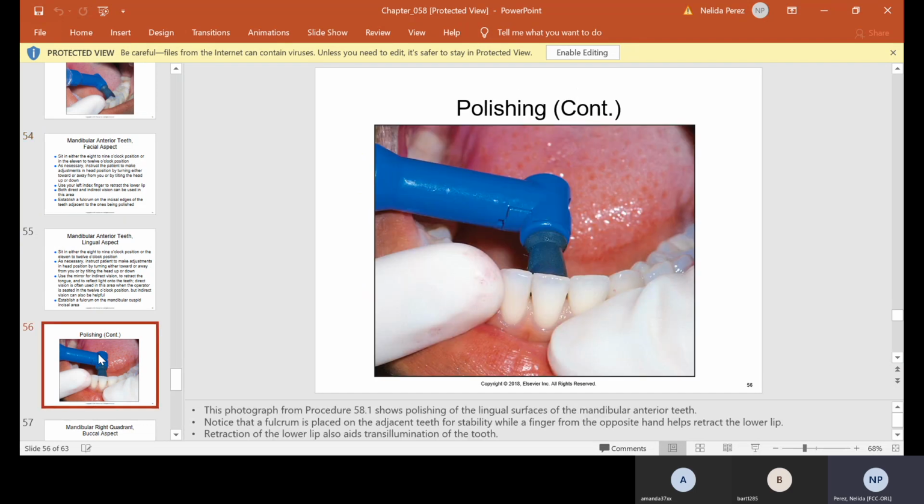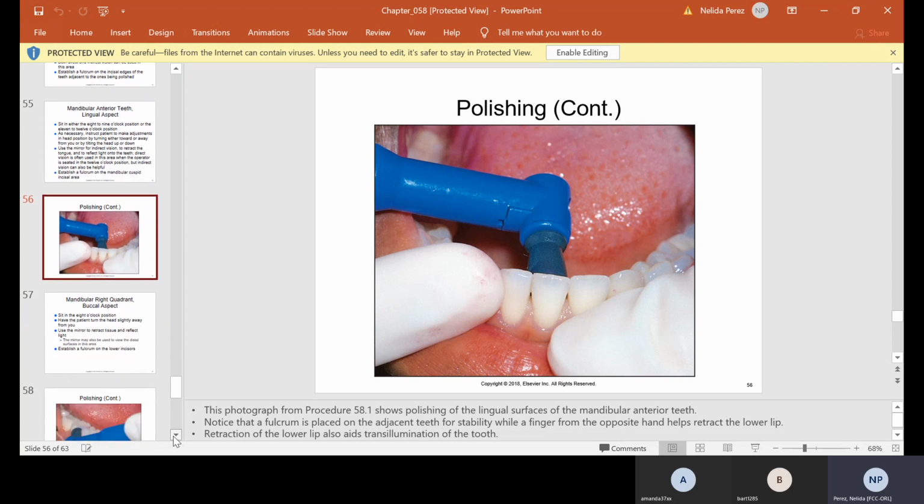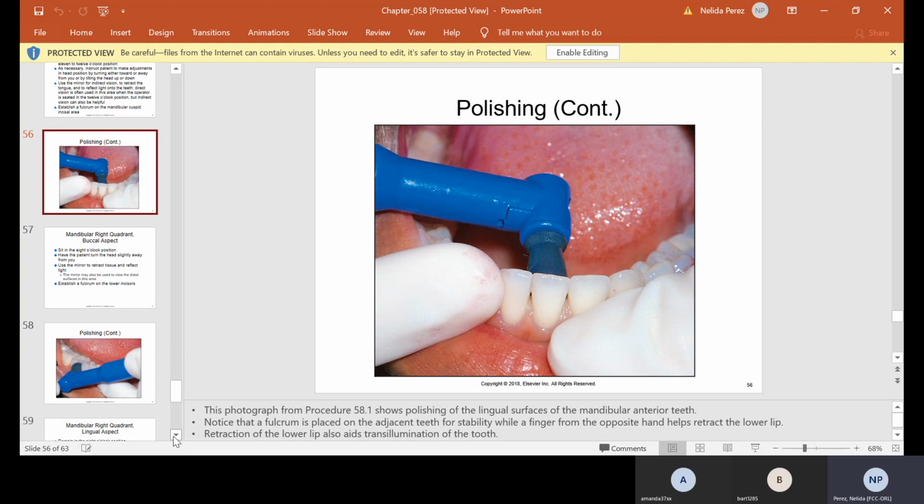The other thing that I see has not been mentioned either is the saliva ejector. The saliva ejector should be in the mouth, and it should be the opposite of where you're working at. So of course, if you're working on the right, it should be on the left. When you go to the left, move it to the right. Okay, and here is of the lowers on the lingual. Notice how their finger here is used as a fulcrum.